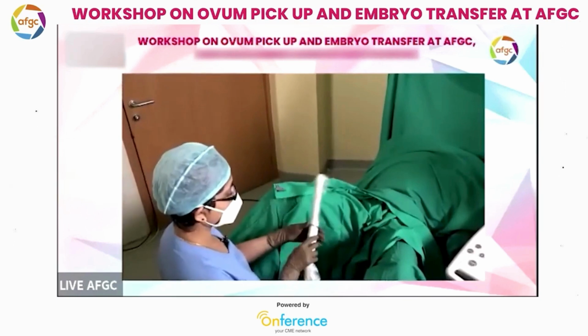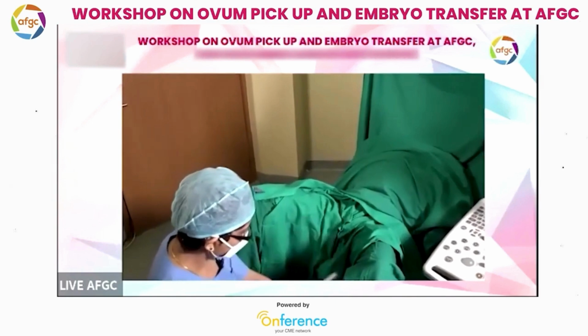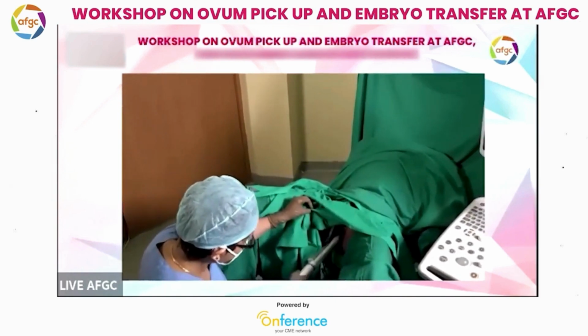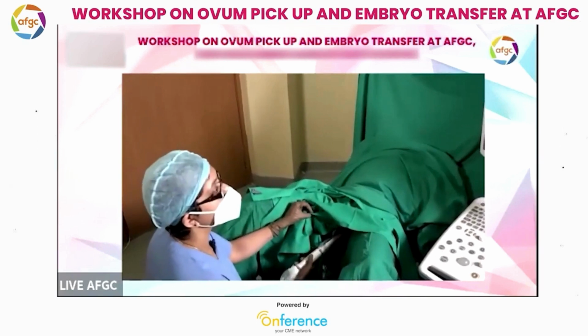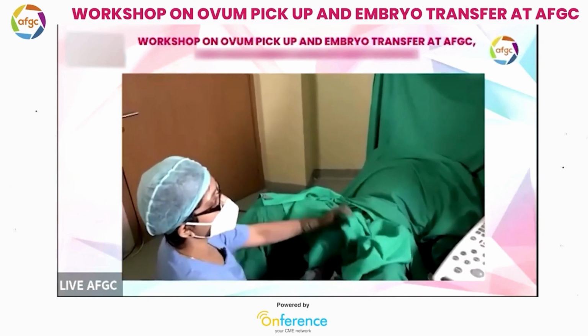What is the LMP, please? Doctor? Okay. So, the probe is inside.